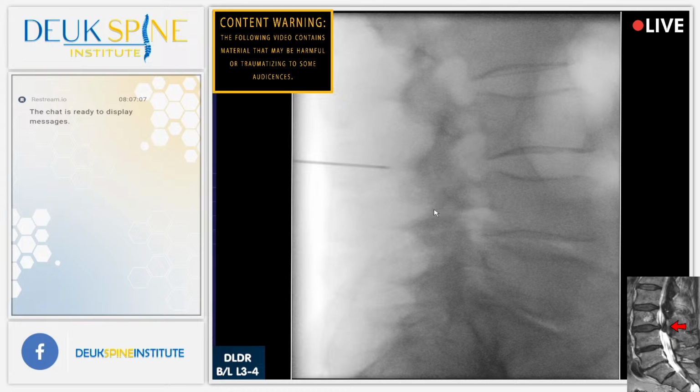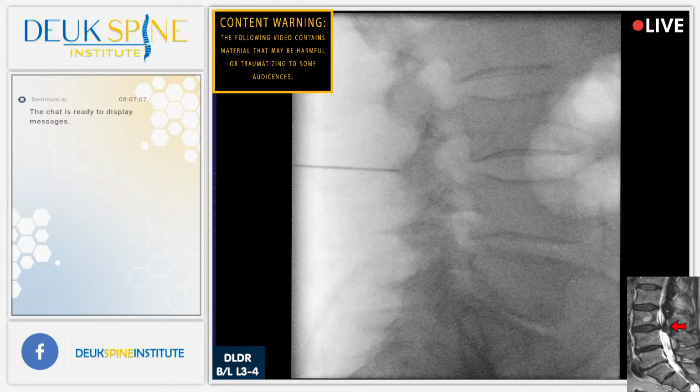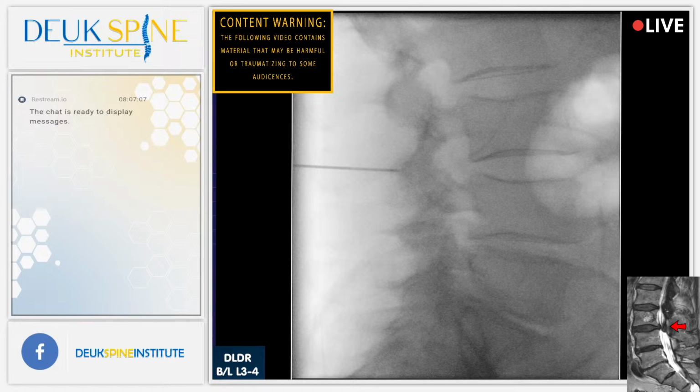You can actually see the herniation on the x-ray. Yep, that's it. It's huge on both sides. Okay, so that's what our target is. You can see the needle is heading there. Thank you, Jordan. Great job today. Thank you, sir. Any questions from the audience so far? No current questions.